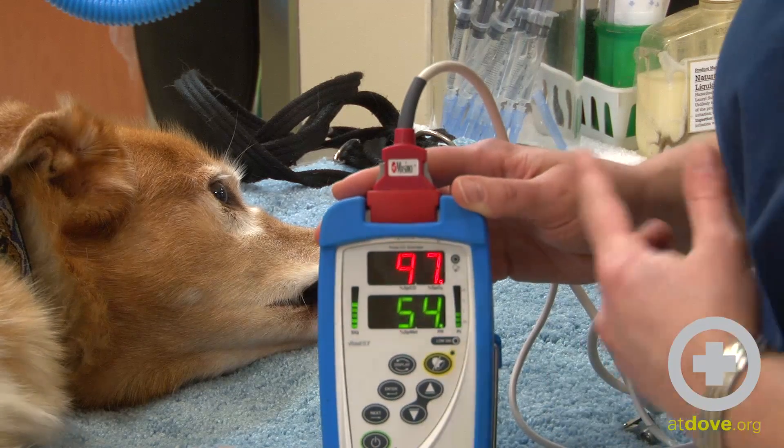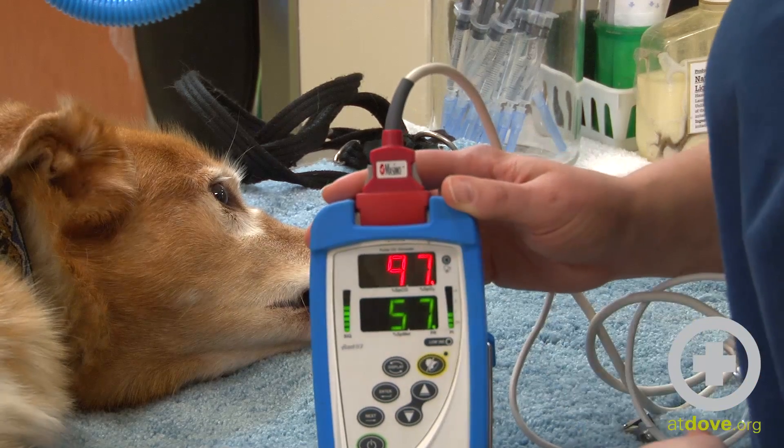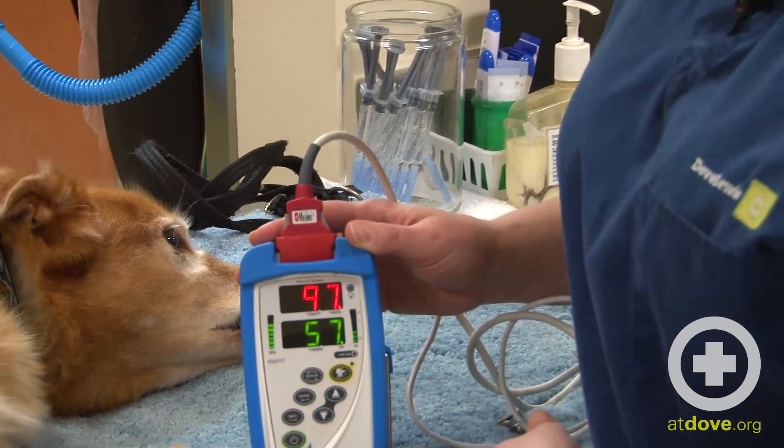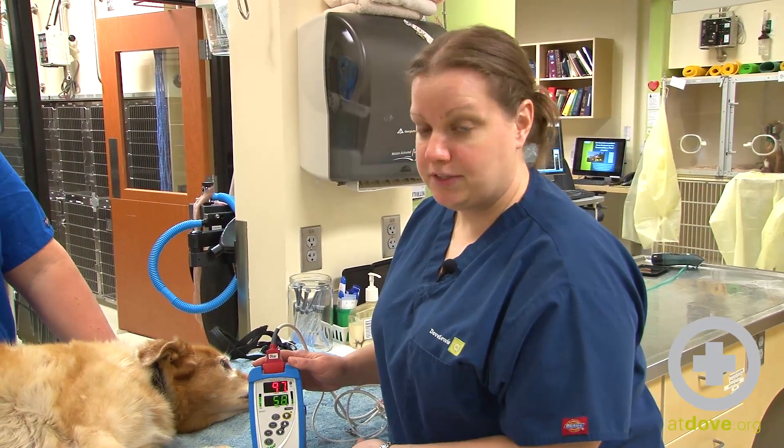This top number here is the percentage of hemoglobin that's saturated with oxygen. So she is at 97 percent — for a dog breathing room air, we like it to be anywhere from 95 to 100 percent. So I'm very happy with that 97 percent.